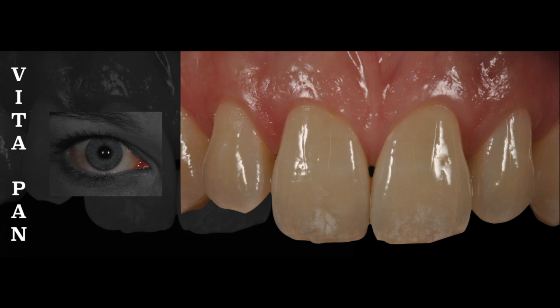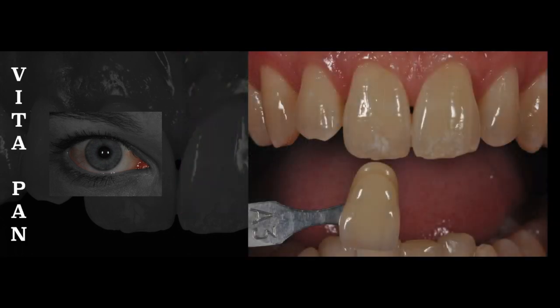Let me show you clinically what this means. If we were to position the Vita Pan A3 shade tab, as seen on the photo, you are trying to compare the more saturated portion of the shade tab to the tooth structure and not that middle third area that the dental companies actually try to match. This will most likely have you choose a lighter shade than needed.